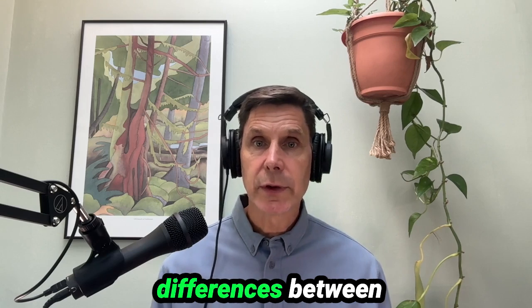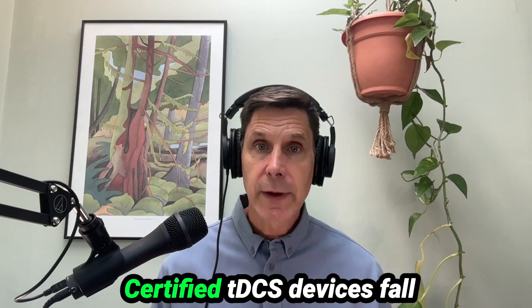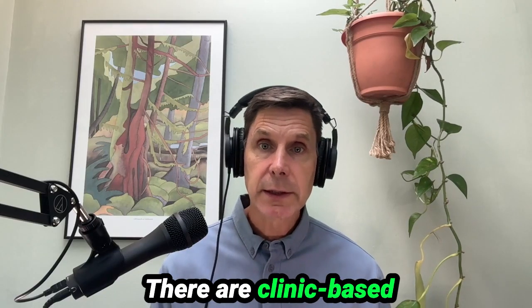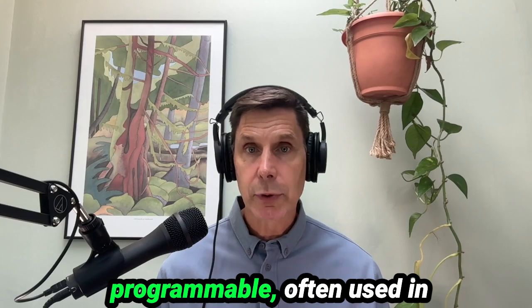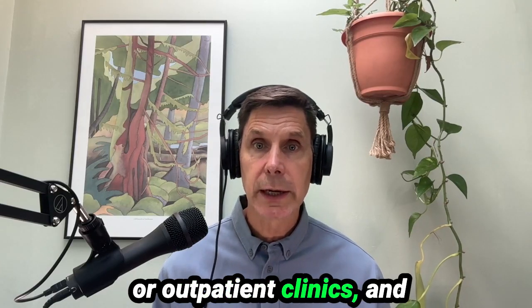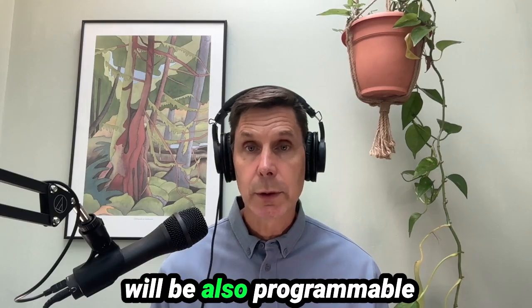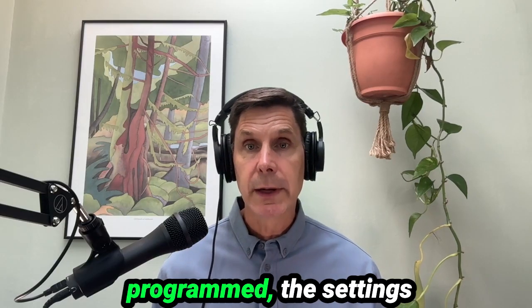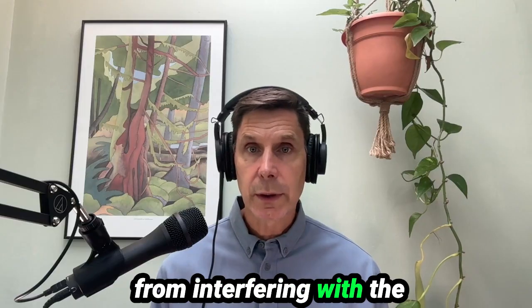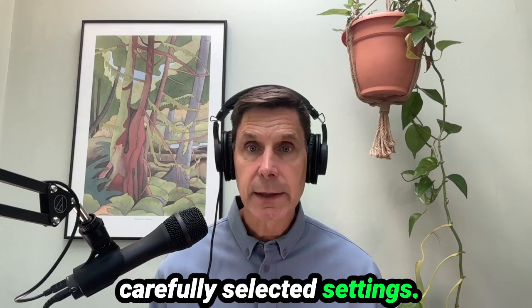Now let's look at some differences between clinic-based versus home-based device use. Certified tDCS devices fall into two main categories. There are clinic-based devices, which are typically programmable, often used in clinical trials or in hospitals or outpatient clinics. And then there are home-based devices, which typically will also be programmable, but once they're programmed, the settings are locked to prevent people from interfering with the clinically prescribed and carefully selected settings.